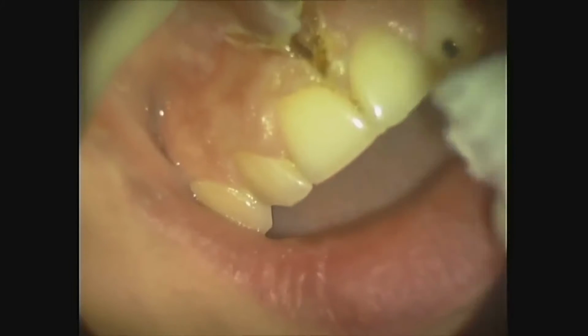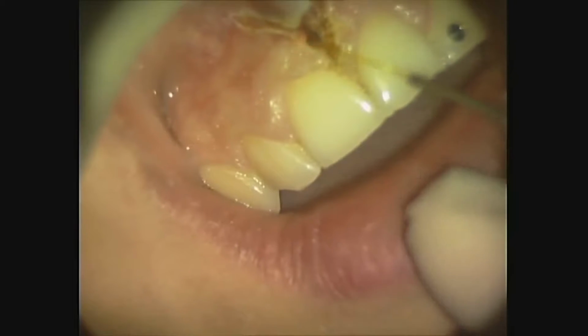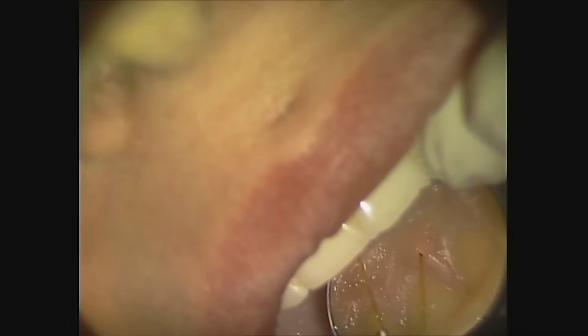Okay, please. Good. Okay. 1, 2, 3, 4, 5, 6, 7, 8, 9, 10. We can go on the palatal side to do the same. Clean my fiber, please. Thank you. 1, 2, 3, 4, 5, 6, 7, 8, 9, 10, to remove any connective and fibrous tissue. Look at the result. This is the first result.